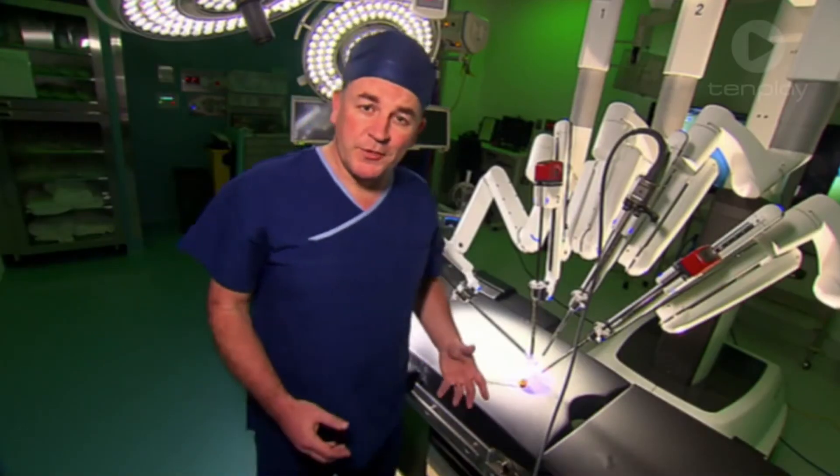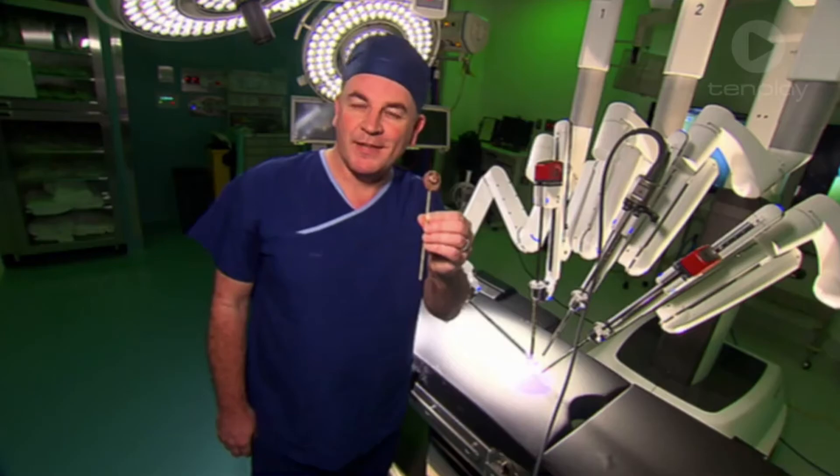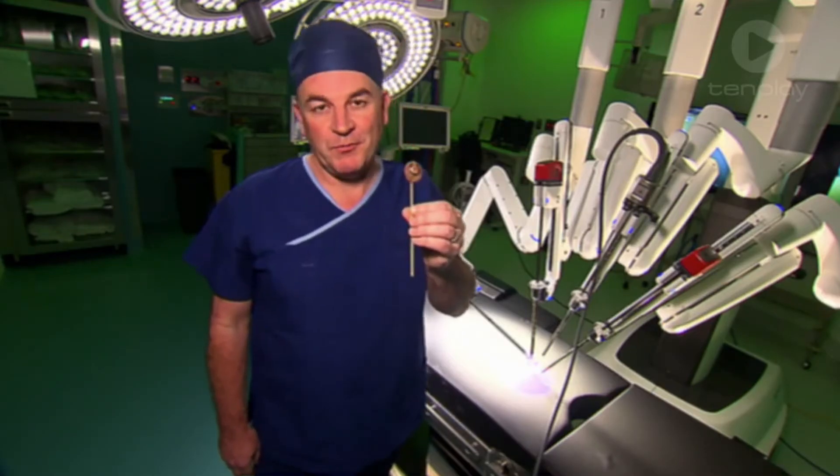The surgery is all done, and thanks to the robot, Grapey just has a few tiny stitches and he can get home to his family much sooner. How do you feel, Grapey? I feel much better. Thanks, Declan. Thanks, surgery robot.